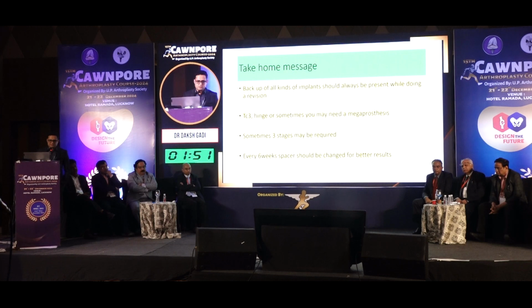So the take-home message is that backup of all kinds of implants should always be present while doing a revision. TC3, hinge, or sometimes you may need a mega prosthesis. Sometimes 3 stages may be required, and every 6 weeks the spacer should be changed for better results. Thank you.